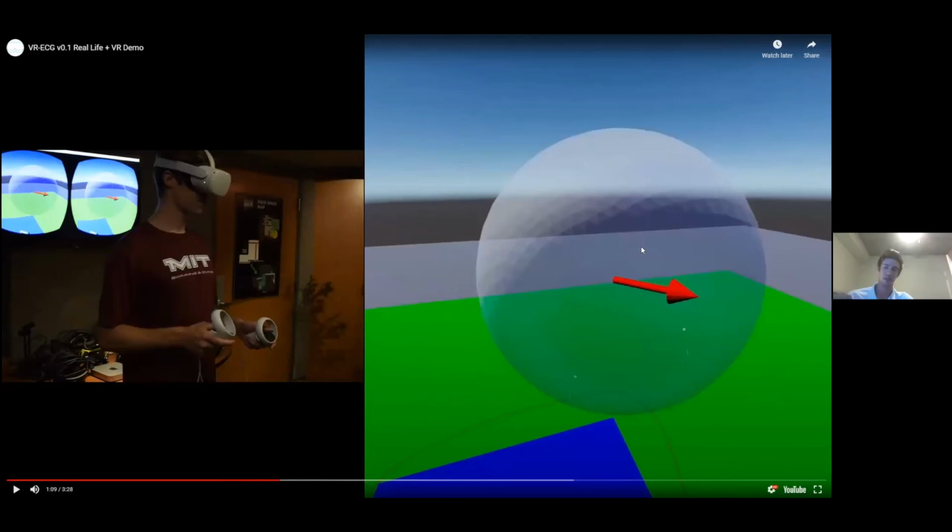This is a 3-dimensional visualization. And this is something that VR gives us the ability to do that other programs might not. For us, this doesn't look that special because we're looking at it from just a normal computer screen. But if you actually go in VR, you're able to get a much better sense of the 3-dimensional aspect of this vector.